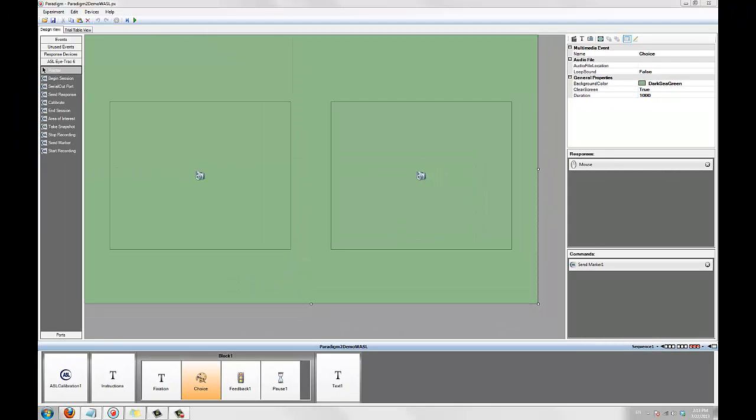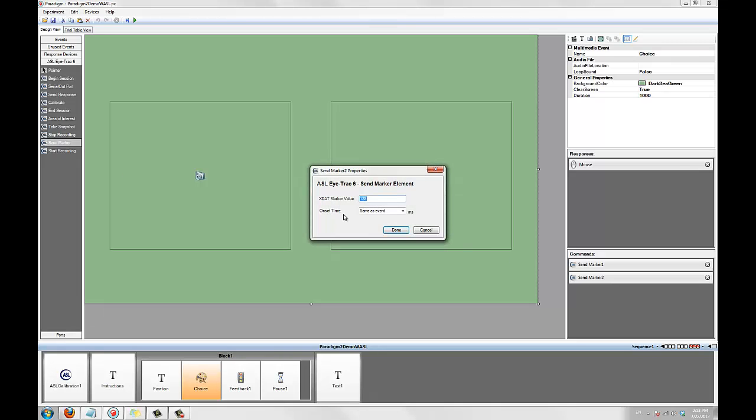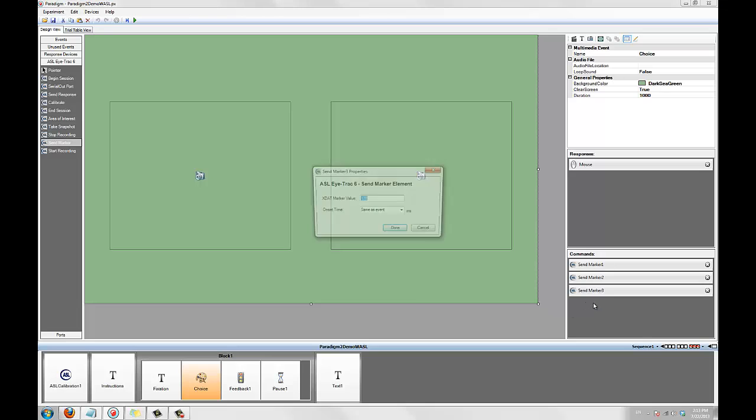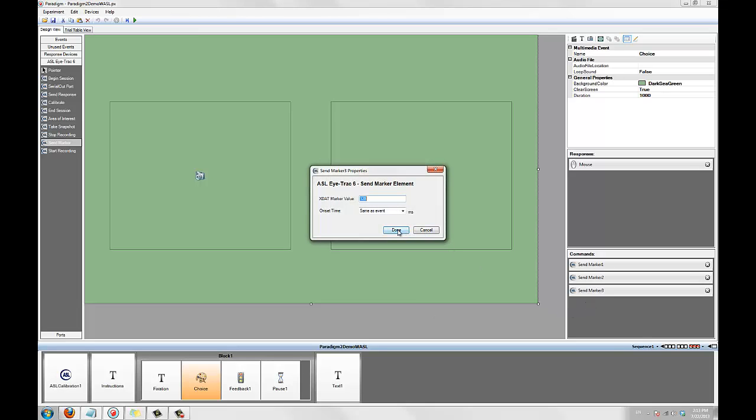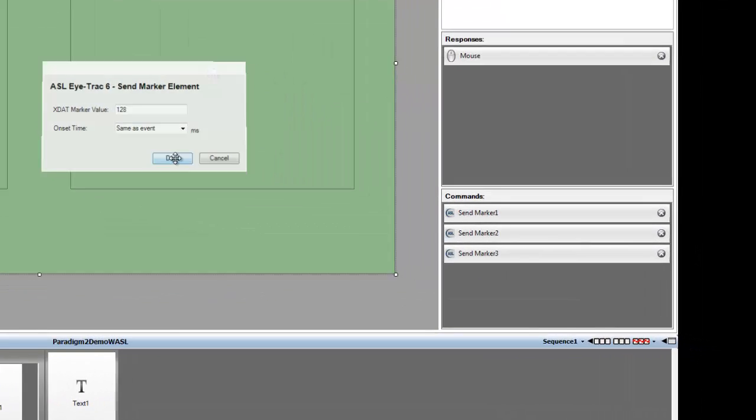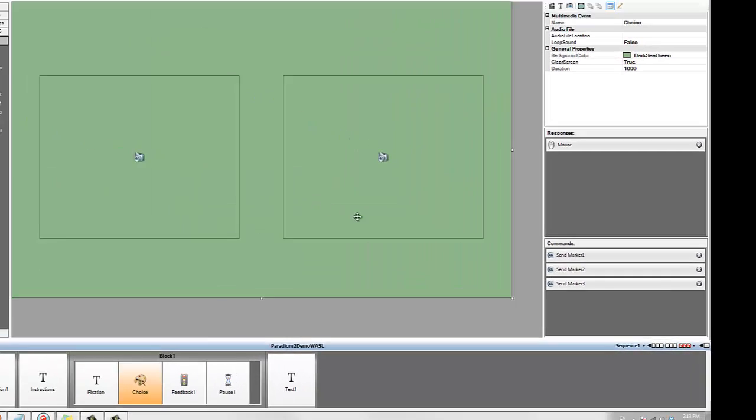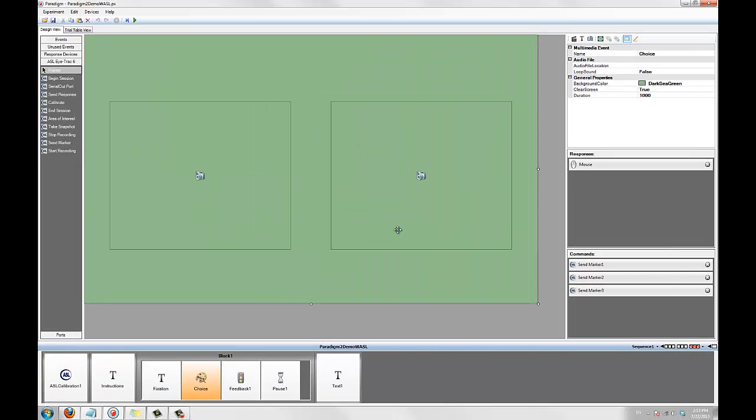You can also add multiple sendMarker elements to a single event, like so. This allows you to send multiple XDAT markers during a single stimulus. When you combine this with the onsetTime property, you can send multiple XDATs at different points during any stimulus.